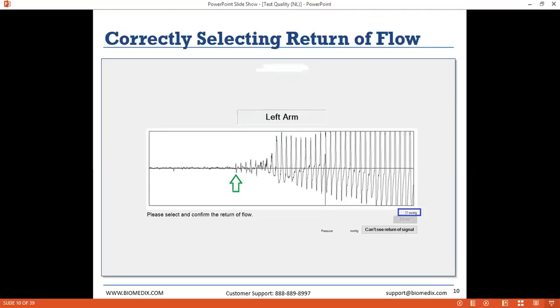Just like with the PPG probe, you should be able to see a peak and a trough, and you want that pattern to continue as the cuff loosens as you move from left to right. So on this demo study, it's pretty easy to see where the first actual pulse is. I've highlighted it with the big green arrow here, right where you can see a strong up and a strong down, and the size of that pulse increases gradually as the pressure on the cuff loosens. I also want to highlight the blue box in the bottom right-hand corner, where it currently says 77 millimeters of mercury.